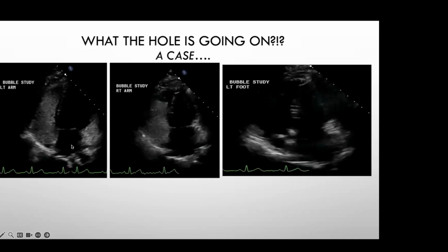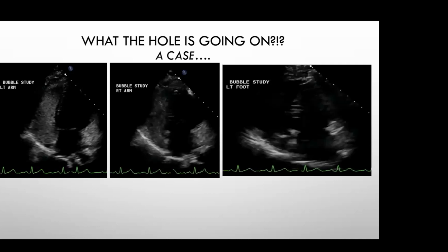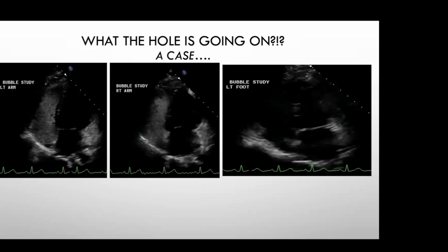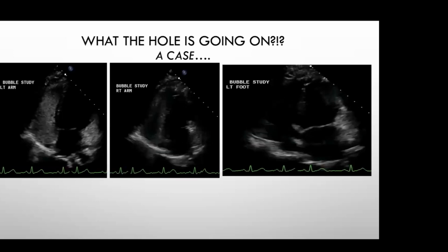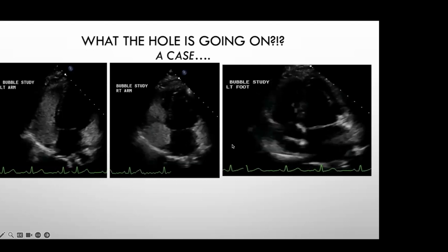And then on the left foot injection, the bubbles aren't as prominently seen as in the other pictures, but if you can squint, there you can start to see some bubbles coming into the left and right chambers.